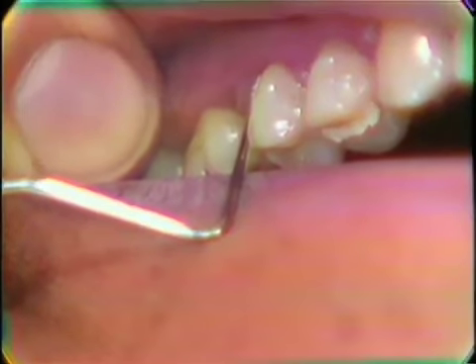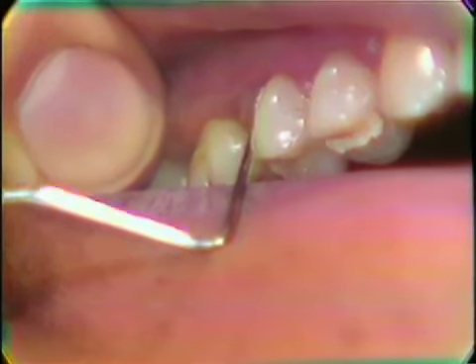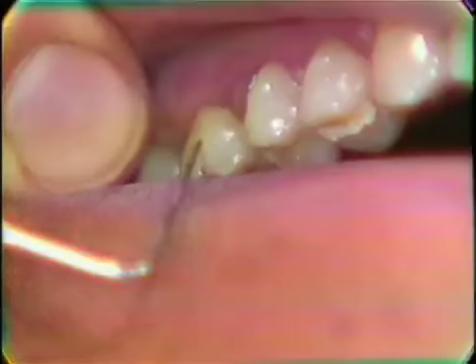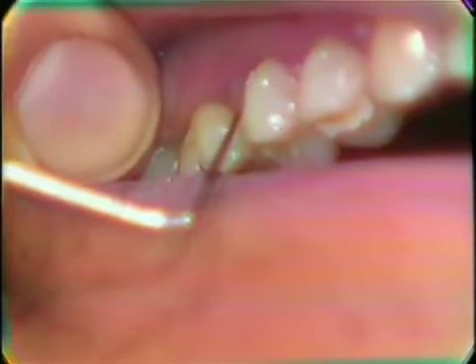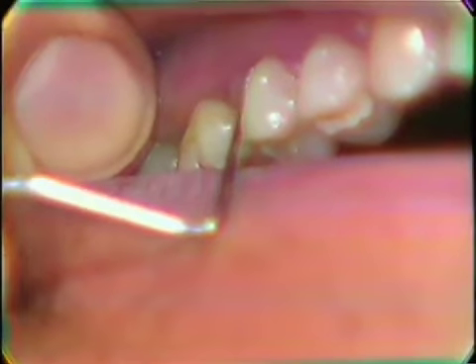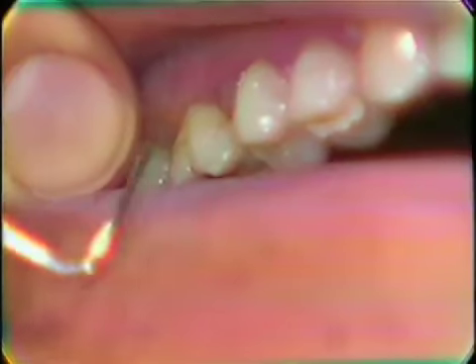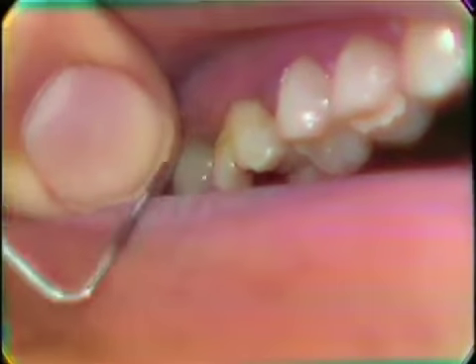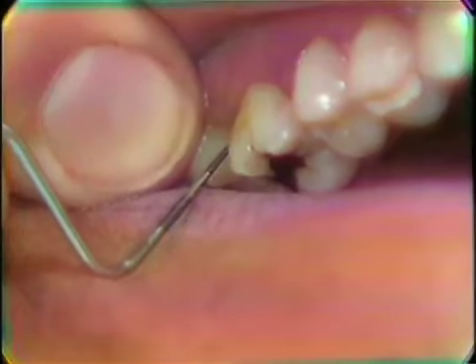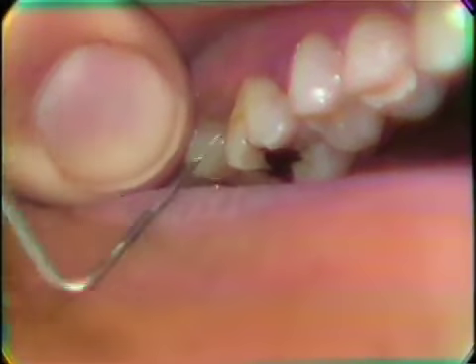Three measurements will be made on each tooth, both for recording the distance between the free gingival margin and the cementum enamel junction, and three measurements will be made to record the pocket depths, both at the mesial buccal, the midpoint on both buccal and lingual, and the distal buccal. These same measurements will be made both on the buccal and the lingual of the tooth.